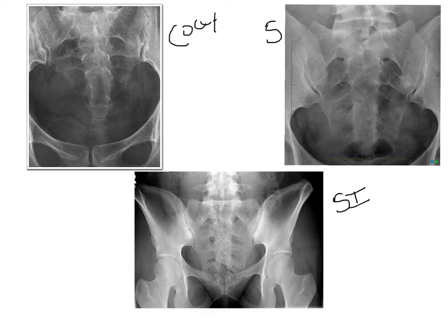The best way to study these AP axial projections, just like we're doing here today, is putting them all out in front of you and really getting to understand and know the differences, because they all look somewhat similar. So putting them together and comparing the differences allows you to work your way through the process of eliminating which projection it is or is not.